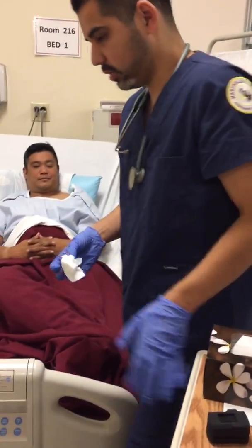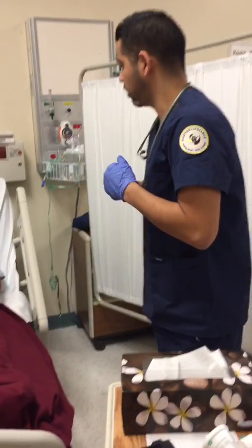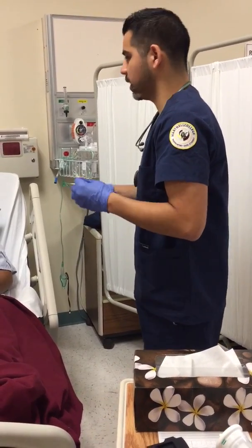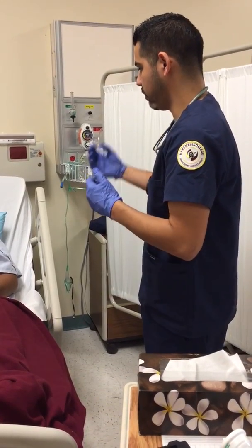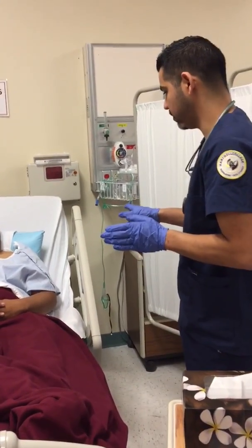Okay. All right, Richard. So what I'm here today for is I'm going to be giving you a breathing treatment. It's going to help open up those airways, because right now they're constricted. It's called DuoNeb, and it's a combination of a bronchodilator and a drug that maintains your breathing throughout the time of day. Okay.